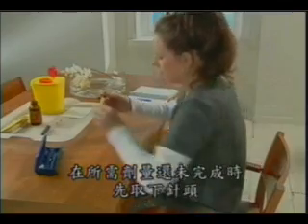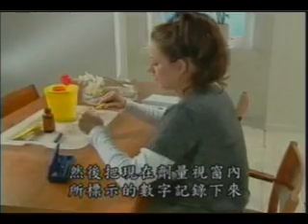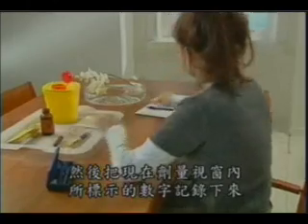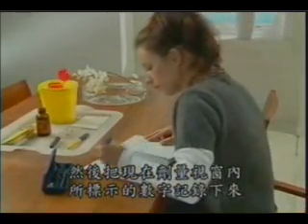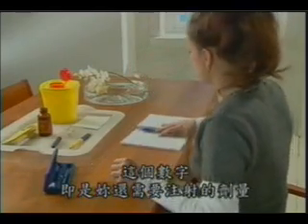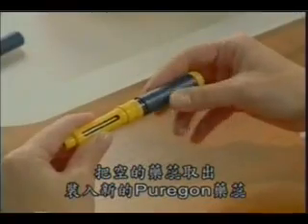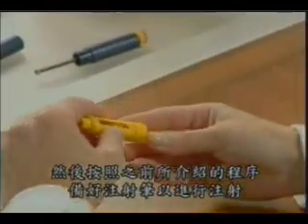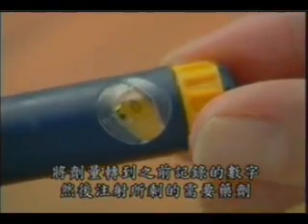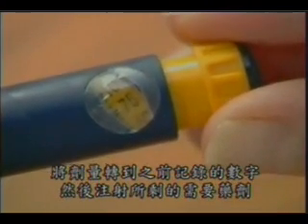If you have not injected the complete dose, remove the pen with the needle attached from the skin and then detach the needle from the pen. Write down the position of the arrow on the dosage scale at the point where the pen stopped. This means you are recording how much Puregon is still to be injected. Remove the empty cartridge. Then load a new Puregon cartridge and prepare the pen for injection, as shown previously. Dial the recorded position on the dosage scale. Inject the remainder of the prescribed dose.